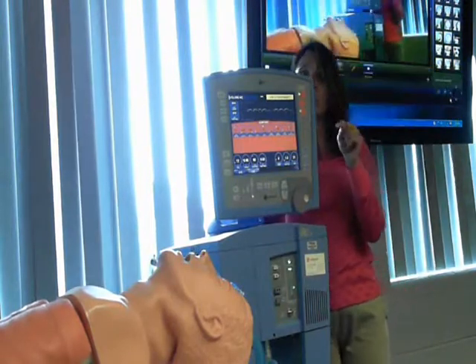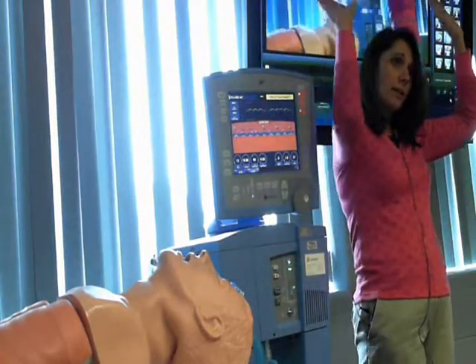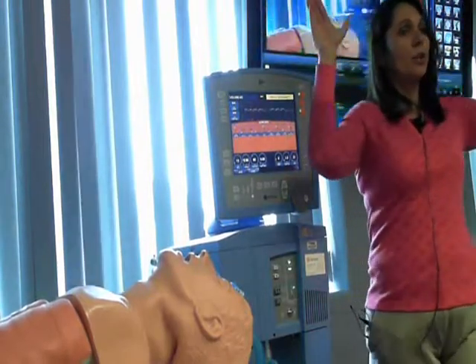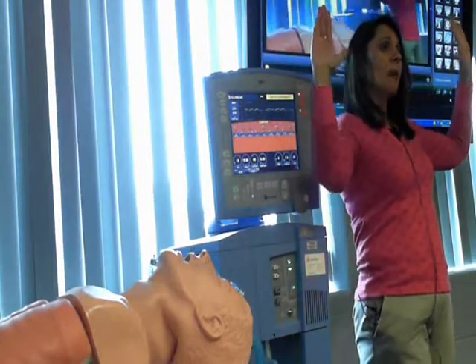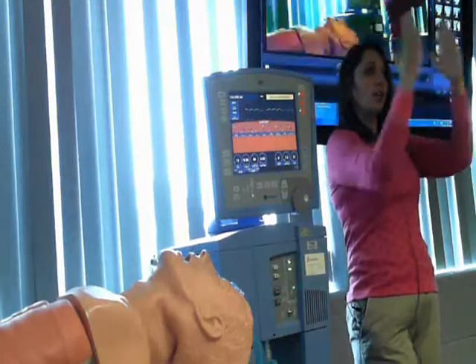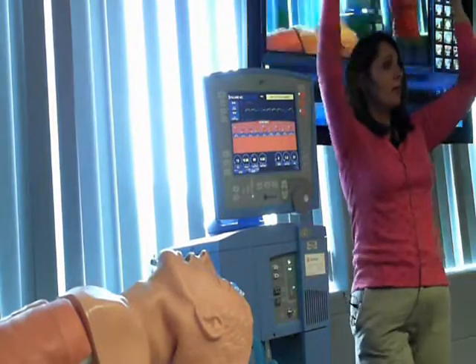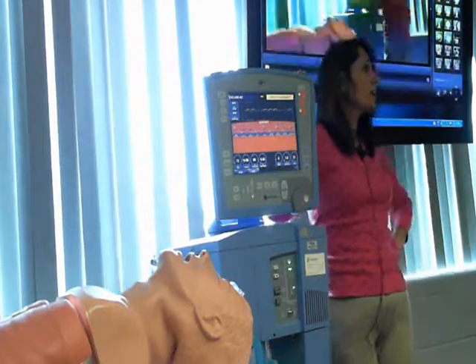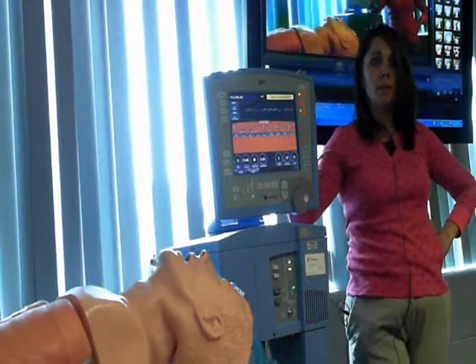This is going to seem really silly to you, but you're going to remember this, I promise. I want everybody to put your hands up like this. Awesome. Okay? Now, what you are doing to your patient if you give them too large of a tidal volume is effectively this. Everybody clap 10 times as hard and as fast as you can. So 1, 2, 3, 4, 5, 6, 7, 8, 9, 10. Look at your hands. They're red. What do they feel like? Tingly. They're tingly. What else are they? They sting. What else do you feel? Do they feel a little swollen maybe?